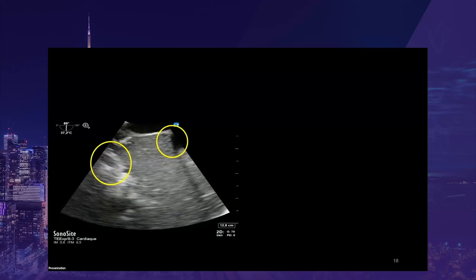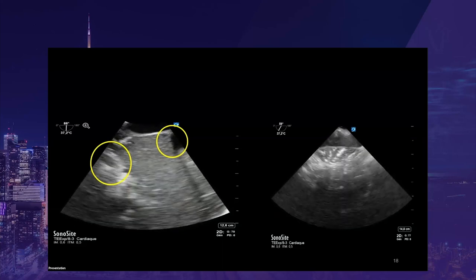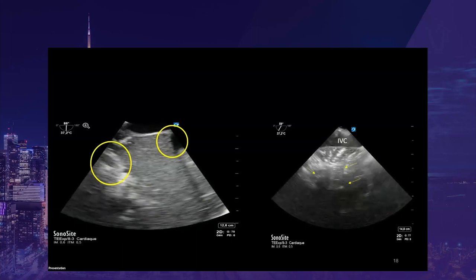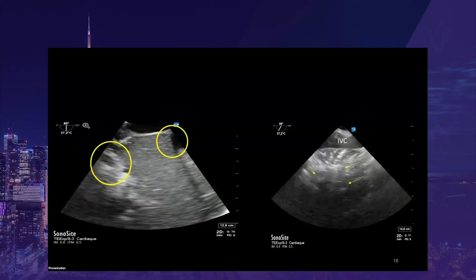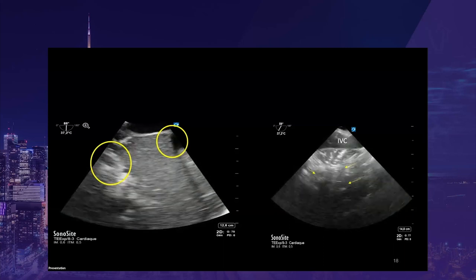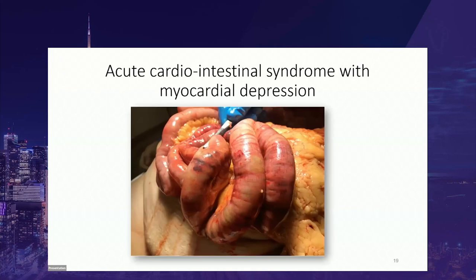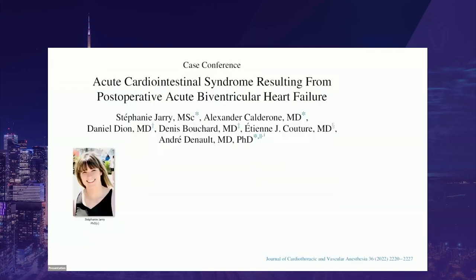The IVC was dilated. As we got closer, we started to see air bubbles in the hepatic vein, and also suggestion of air in the portal vein. When you look closely at the liver, you see white areas all over it, suggesting air in the portal vessels. This patient was developing mesenteric ischemia, which explained her very elevated lactate. The autopsy confirmed the diagnosis. She had developed what we call acute cardio-intestinal syndrome with myocardial depression.